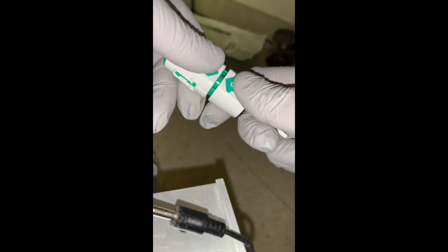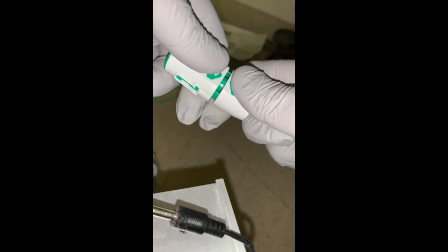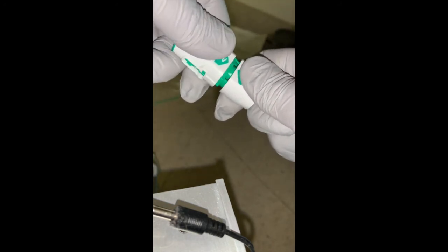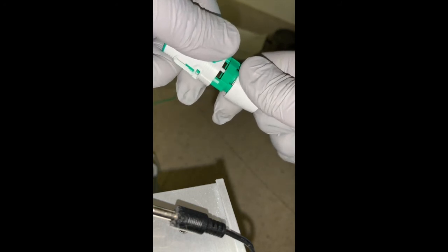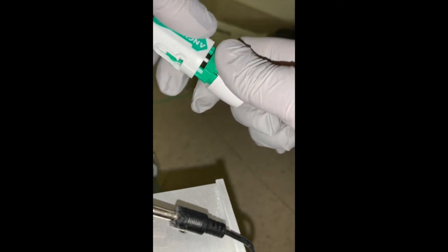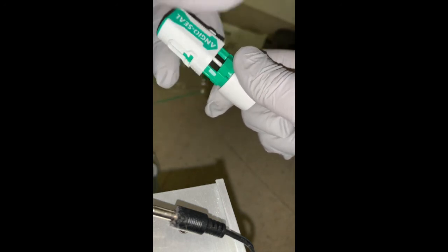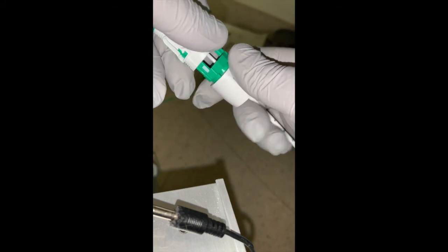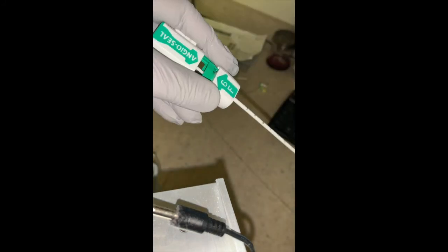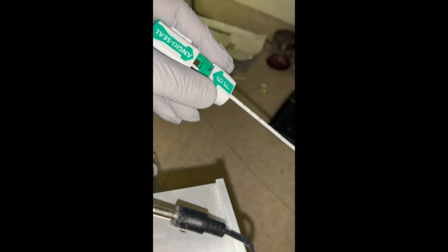Back to deploying the Angiaseal. Some people pull straight up or do a side shimmy by going click and click — either one is fine. Once you've done this, you're ready to deploy. You pull firmly, going side click and click, and you'll hear a double click. Now you can start to pull the entire apparatus outwards out of the arteriotomy site.